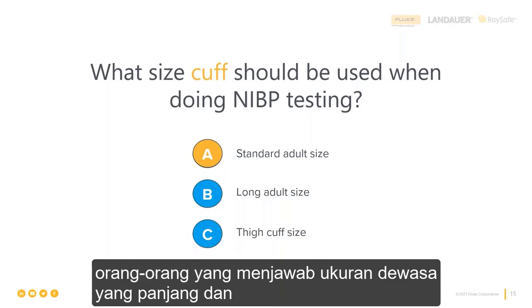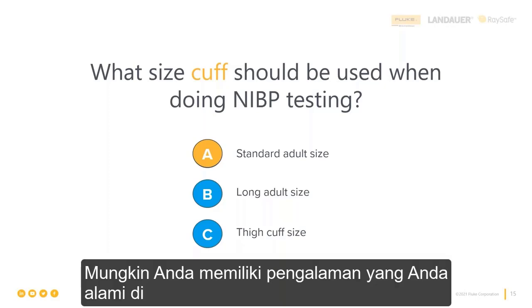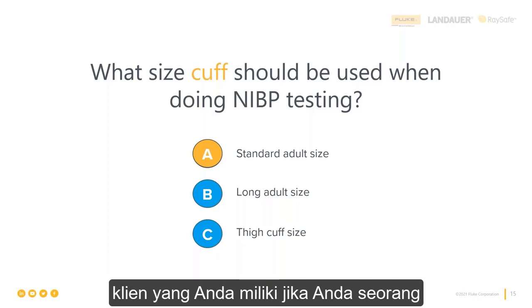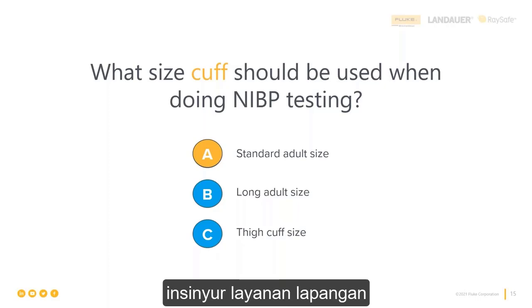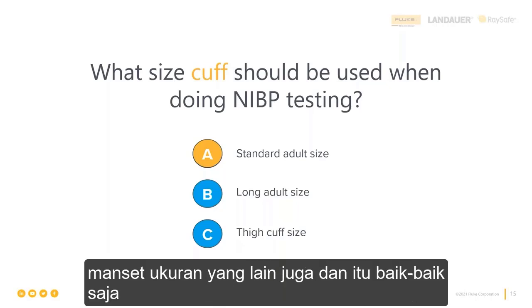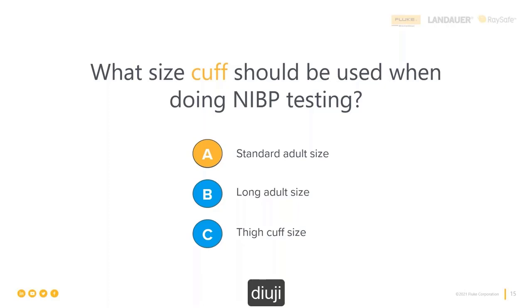The people that answered long adult size and thigh cuff size, the experience that you have in the hospital that you're working in, or the clients that you have, if you're a field service engineer, may cause you to want to test the other size cuffs as well, and that's fine. But the standard adult size has got to be tested.